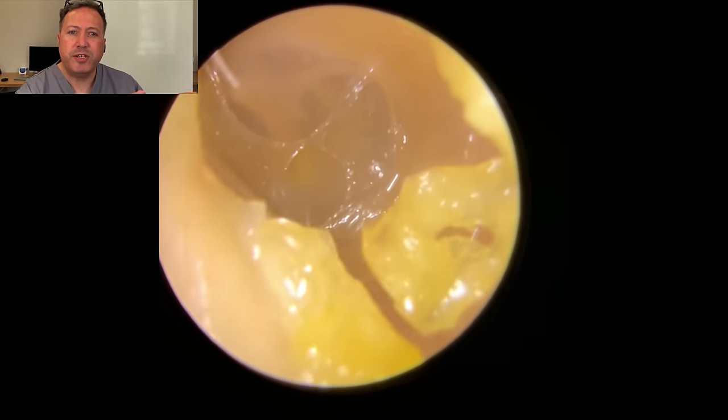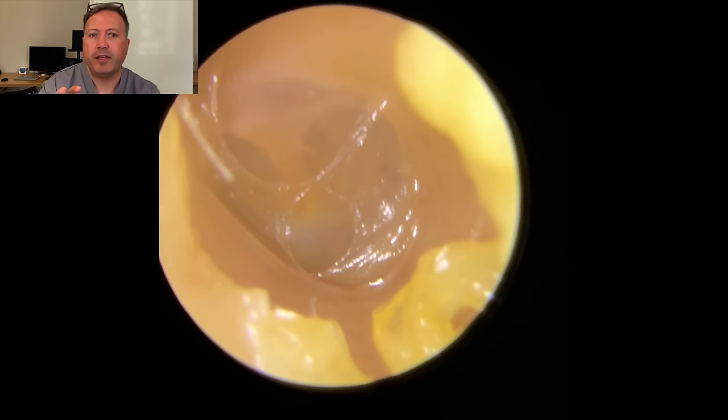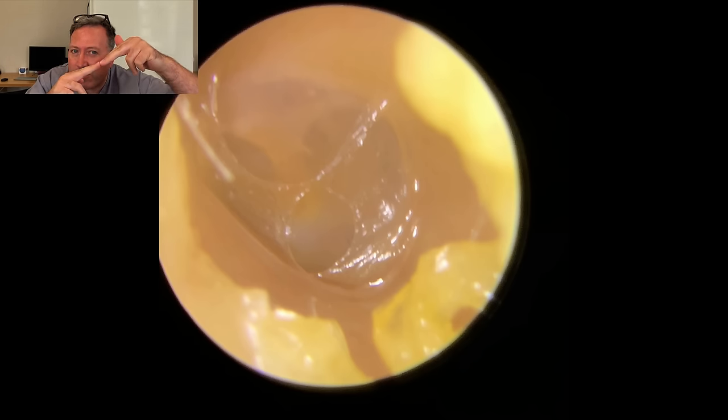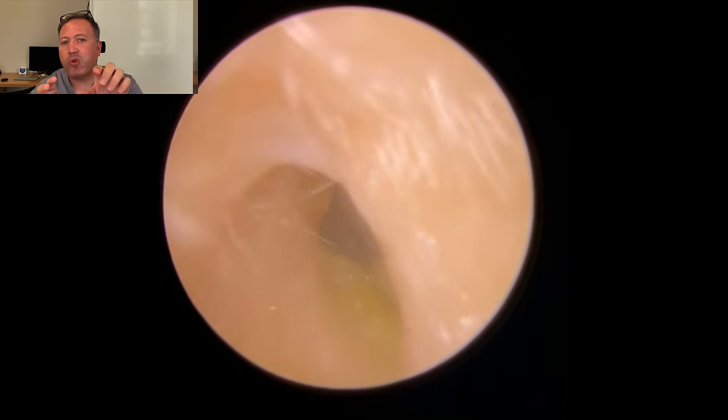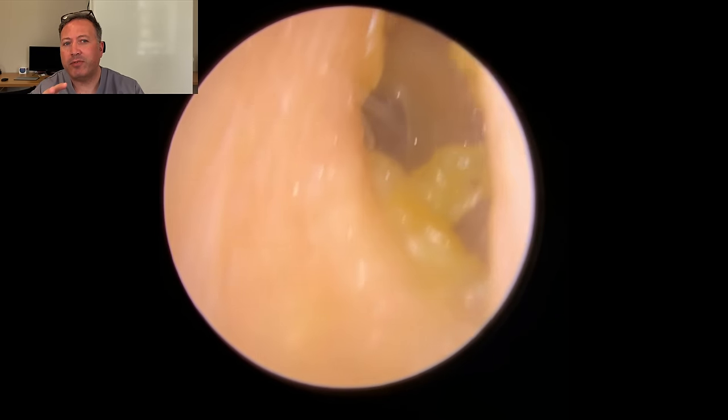So this is a really interesting case, this one. We're going to stop the video in a second. There we go. We've got a really thin, almost spiderwebby thin layer of skin that's building up in front of this eardrum. That's the eardrum there. You can see behind it. But see how it's formed just in front of the ear canal? It's almost just like one skin cell thick. And it's attached, look, in the center. You can see where the two pieces have met. So you've got this hole at the top, hole at the bottom there. And then we've got this dry wax debris around the outside.